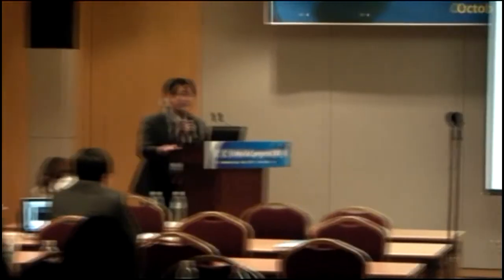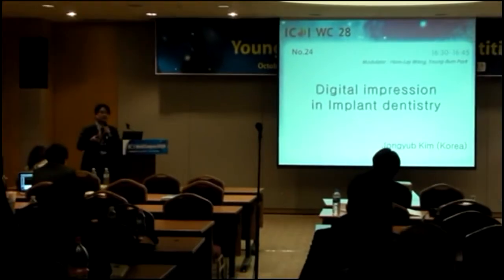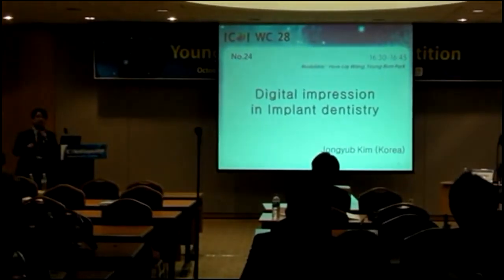Okay, that's a very good question. Let me repeat the question. He asked what kind of implant system you can make a digital impression with, by the ICOI. Yes, that's a very good question. I don't know whether many of you noticed, but I placed a single implant with an external hex. Usually we don't place an external for a single one, right? Usually I love to place an internal connection for a single implant, especially in the posterior.